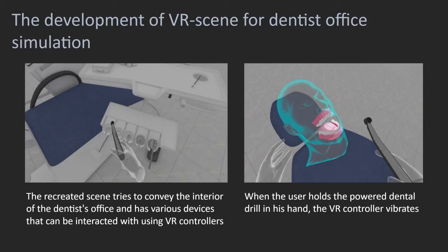For the smoothest display, it's recommended to keep the number of vertices on the scene in a volume of less than 300,000. To do this, you can perform the procedure of decimate polygons using different algorithms presented in graphical editors. One of the algorithms used from the Blender editor merged polygons if the difference between their normal planes was less than a specified threshold.